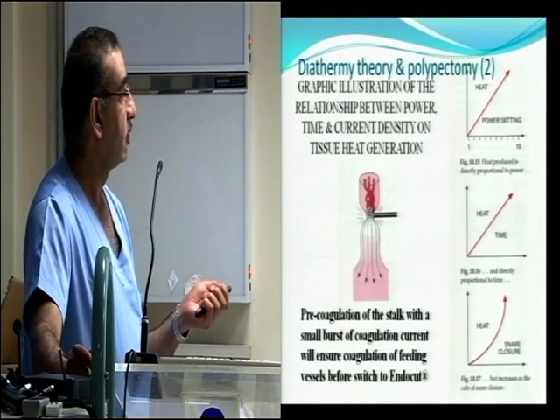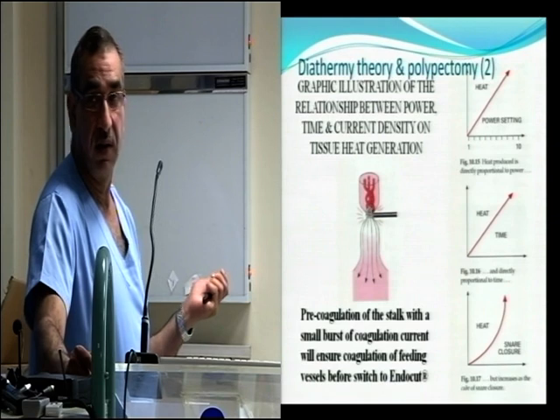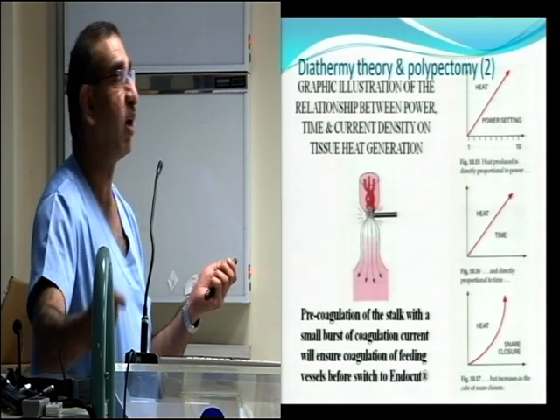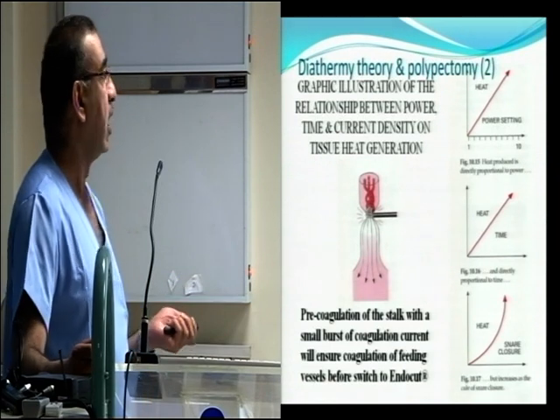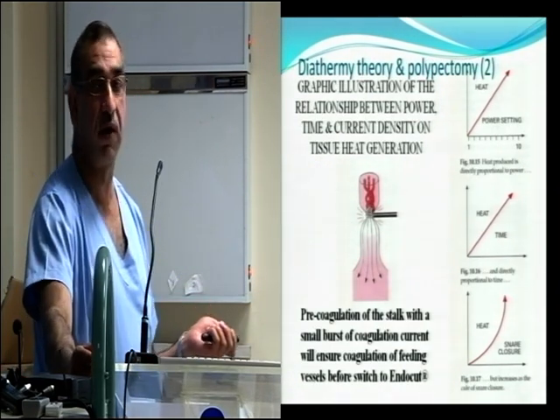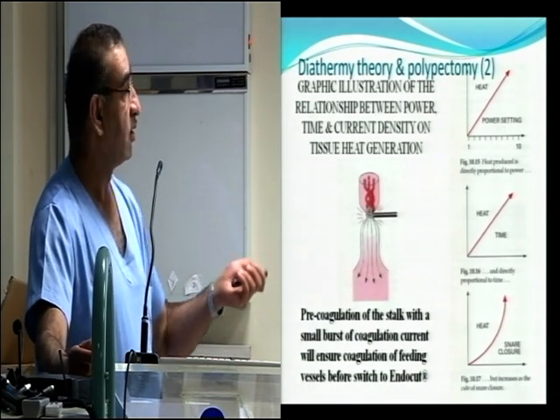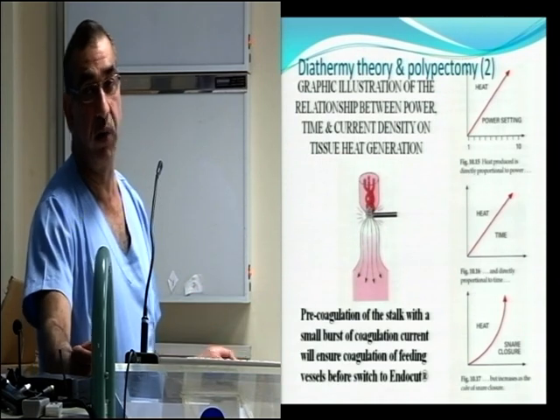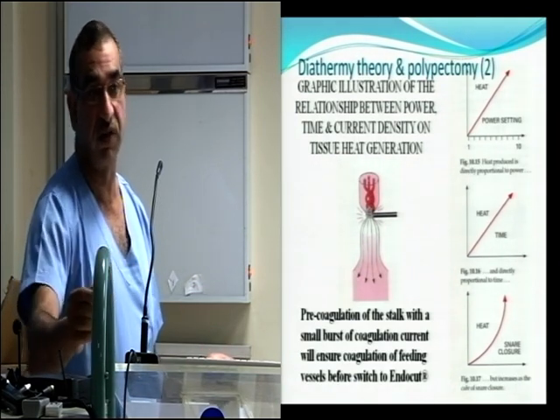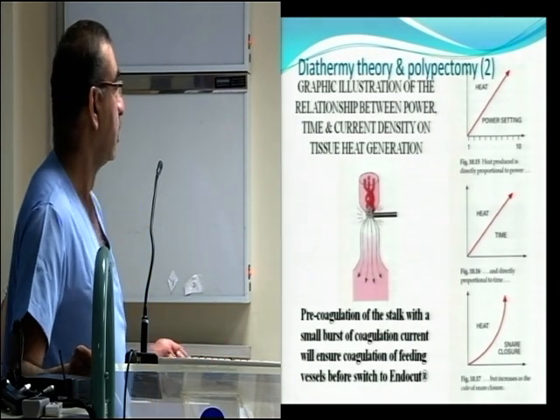You inject another 2 to 3 mils in the head of the polyp. It's always difficult if it's a villous adenoma because you don't quite get into it, but manage to do it and leave the polyp for 15 to 20 minutes. Especially if you find the polyp in the sigmoid colon, you inject your stuff, leave it, complete your colonoscopy. When you come back to it, the polyp has shrunken by that time and you can remove it more safely. So always aim for any safety procedure that you can do.